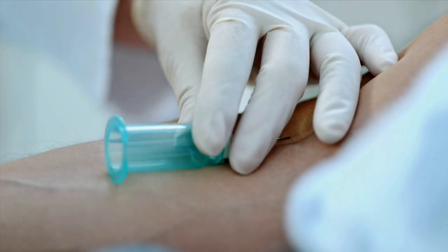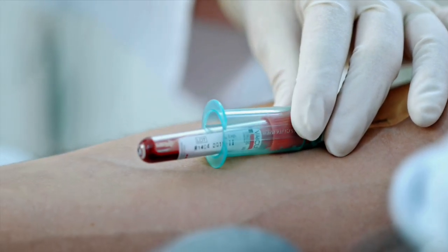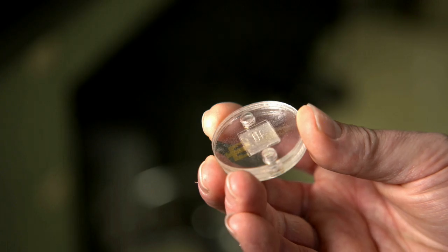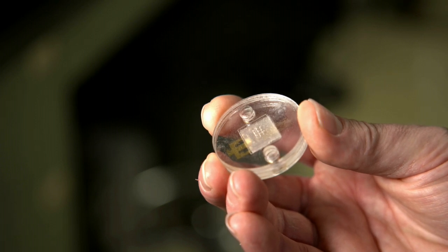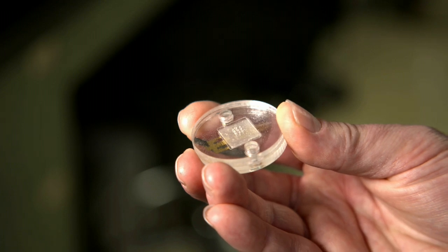Right now, the doctor will measure your blood or your urine — nobody measures interstitial fluid. But there's a lot of potential there as a previously untapped source of rich information for what is going on in your body. The game changer is bringing the doctor's office out of the clinic and onto the individual — something so easy to use that it's continuously monitoring, and a person can be measuring themselves at all times without even being aware that the device is on them.